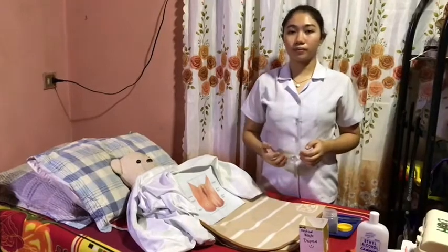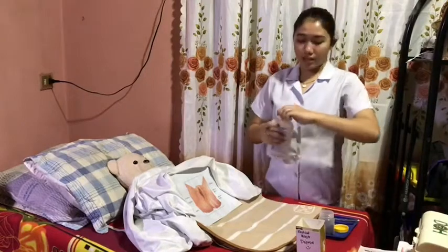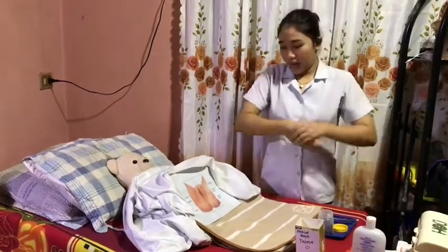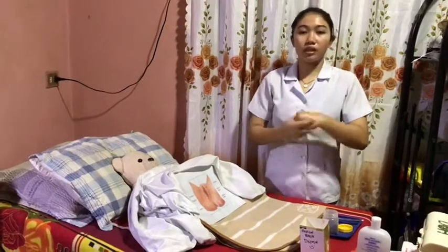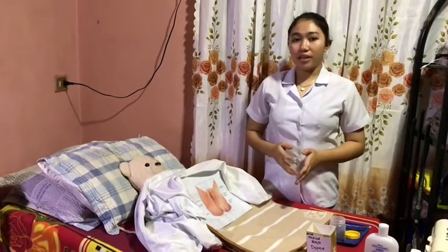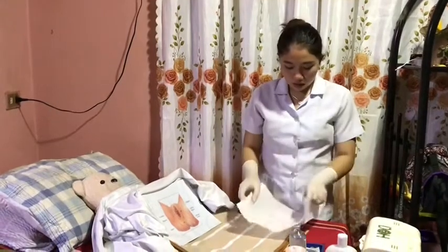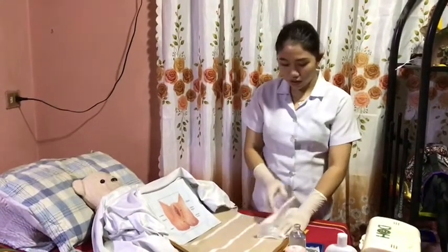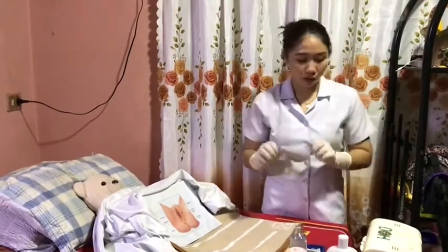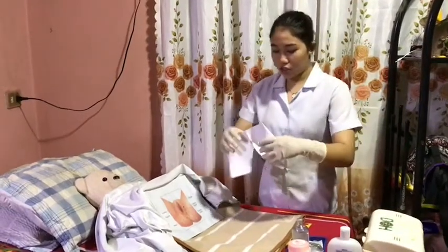Alright. Now, I will be using the 70% alcohol to clean my hand. And use sterile gloves to prevent contamination. And now that I'm done wearing sterile gloves, now put the eye sheet to the genital area.